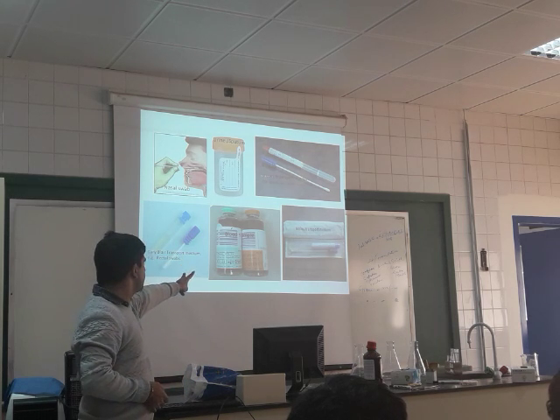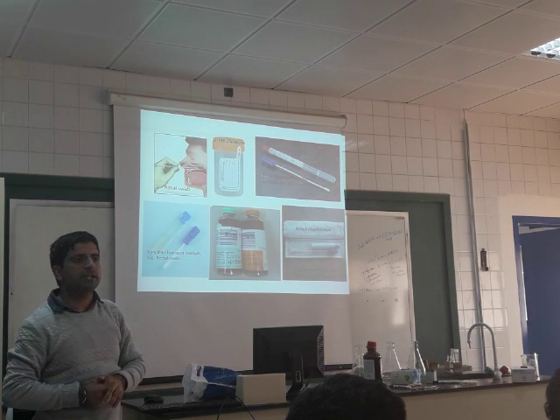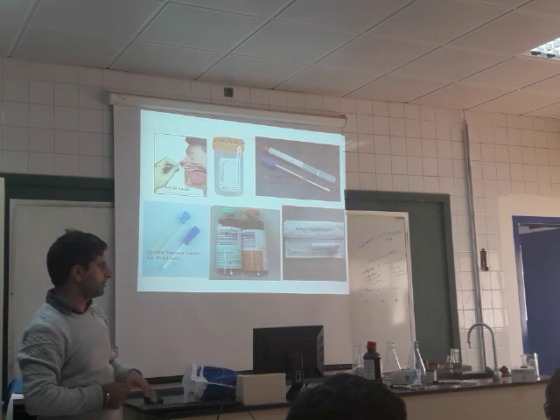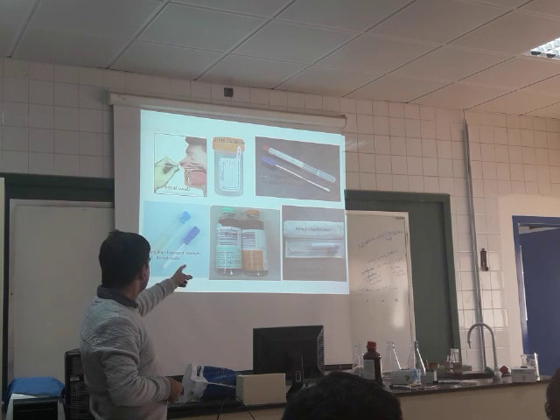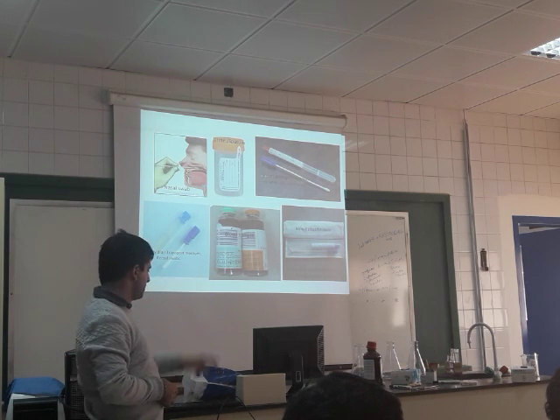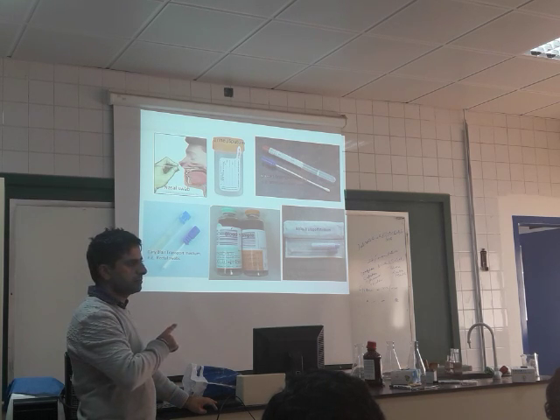For blood samples, we carry two types of blood bottles, one for aerobic bacteria and another for anaerobic bacteria. Which one is for which? The green one is for aerobic and the yellow one for anaerobic. Clear?